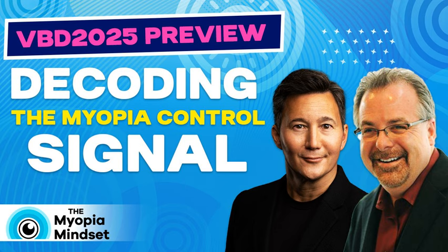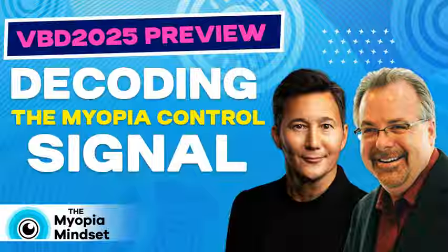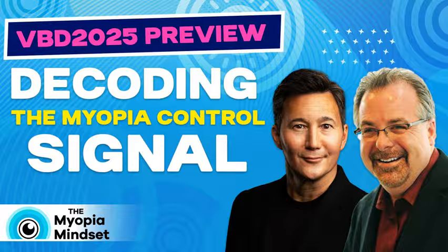Right. So are we saying that orthokeratology as a modality could potentially influence this effect specifically? Yes, because it appears through Randy's work that as we increase the plus power, the plus signal in the periphery, we get a better myopia control signal to the eye and less axial eye growth.